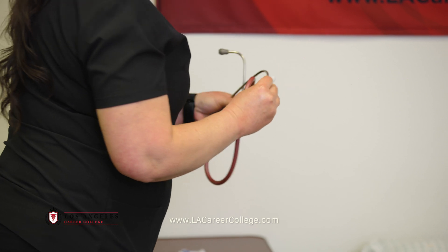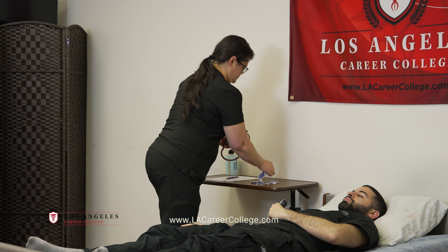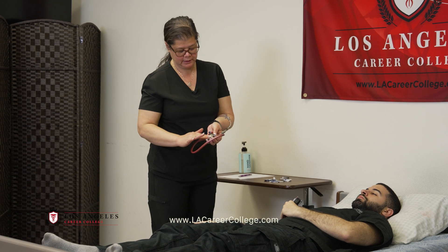Clean your stethoscope ear pieces again. Clean the diaphragm again.